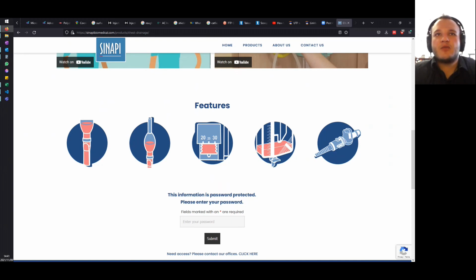But yeah, it was actually very handy to have. Like I said, it cut prototyping time down quite a bit and allowed us to see what we were going to see through our tests without actually having to manually build the prototypes and make the components. Yeah, that's all I have to add.